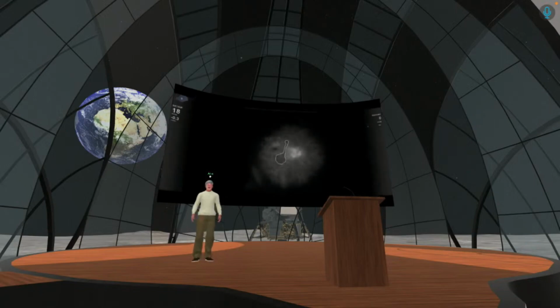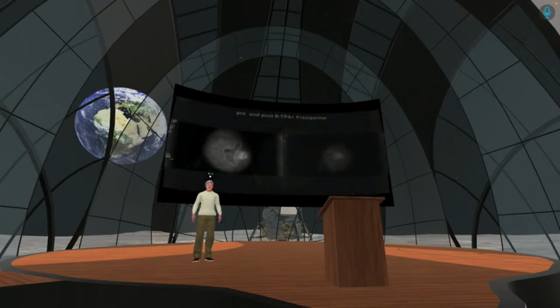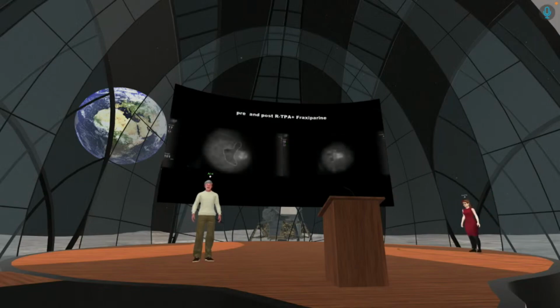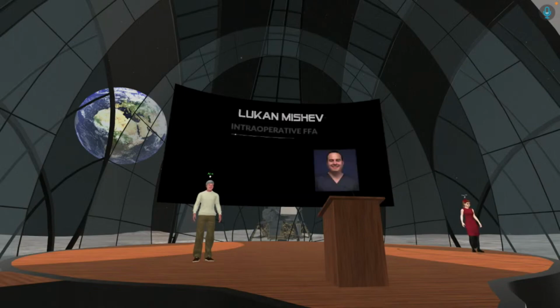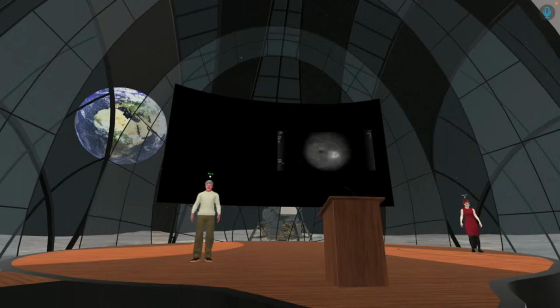Lukan, these are outstanding, and I think a couple of things. This is such a new technique that we're finding new, important information as we go along. The choroidal filling defect is just fascinating. We've seen the little hot spots also with our diabetics, and I don't know if this is your experience, but often when we see these little hot spot leaks, if we flip back to regular visualization, we don't see any bleeding, even if we take the pressure down.